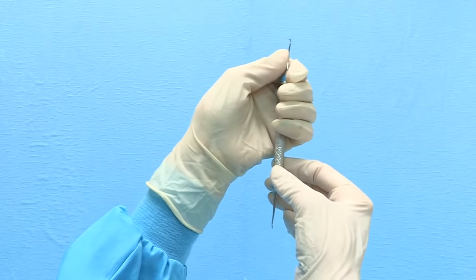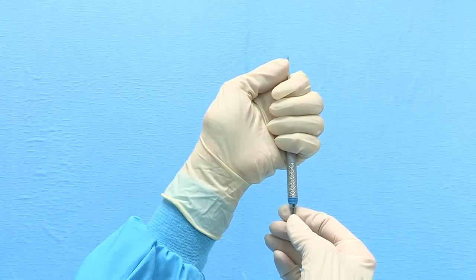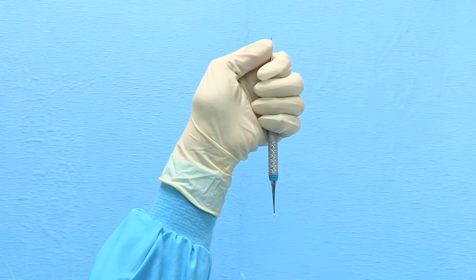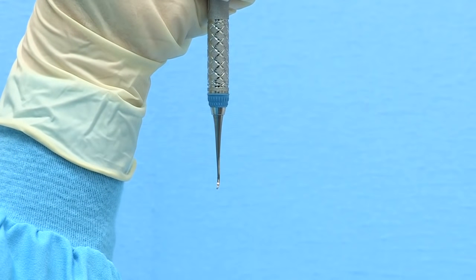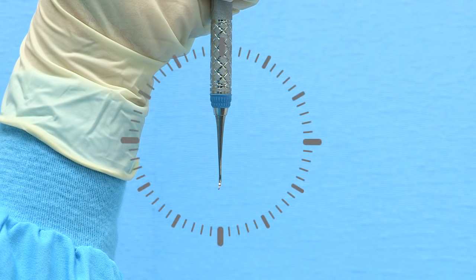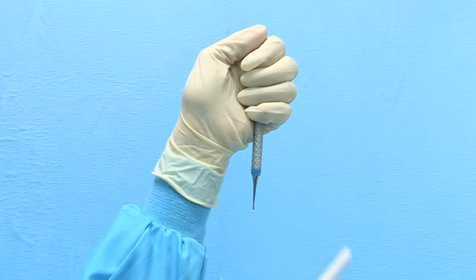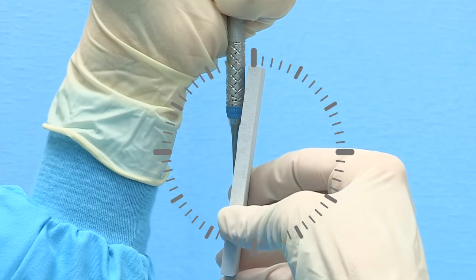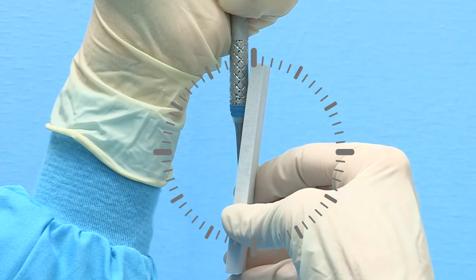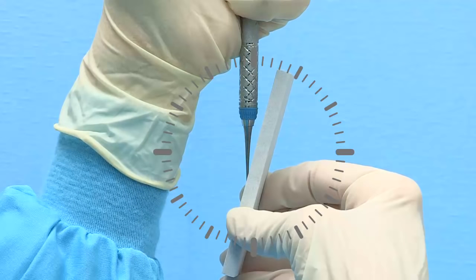Hold the sickle scaler in your non-dominant hand with a secure palm grasp. Brace the top shank with your thumb and place your elbow directly in front of you on a flat stable surface. Using the clock as a guide, hold the instrument vertically with the lower terminal shank positioned at 12 o'clock and the tip of the instrument pointed toward you. Place the lubricated side of the stone against the right lateral surface of the blade. Right-handed clinicians should initially place the stone at 12 o'clock and then tilt the top of the stone slightly away from the handle to approximately 3 minutes past 12 o'clock.